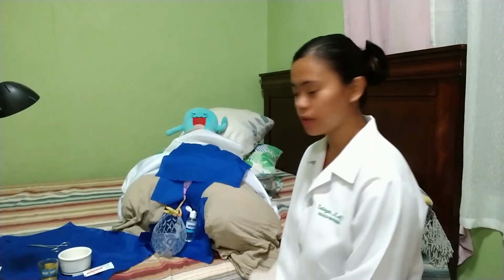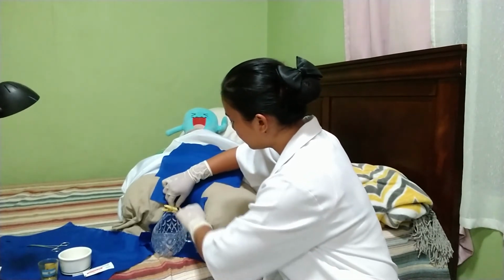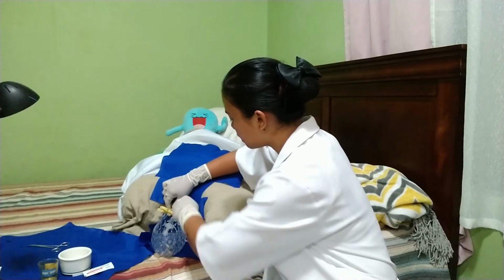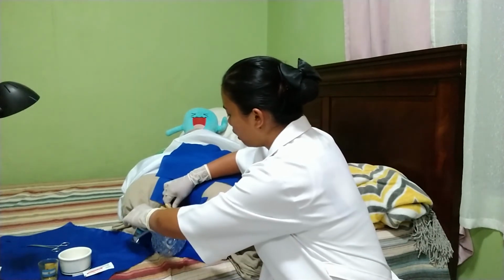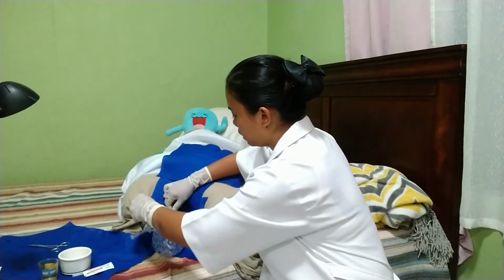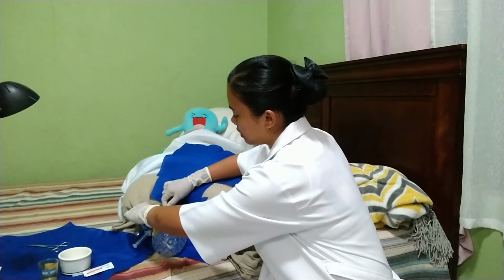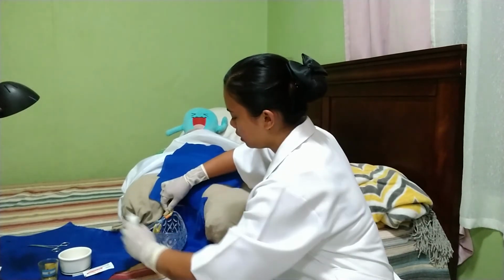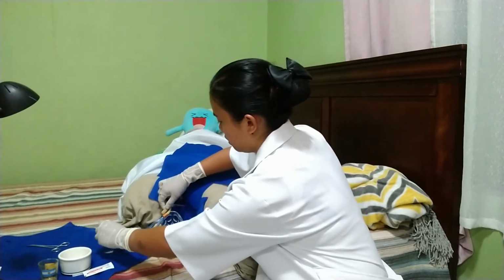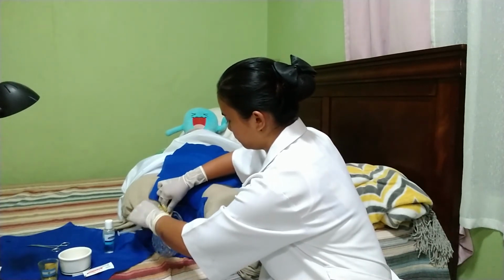The next thing to do is to place a container under the drainage port and fill it with at least 30 cc of urine and cover, and we may set it aside. So unclamp, at least 30 cc, cover, set it aside, and clamp it back again.